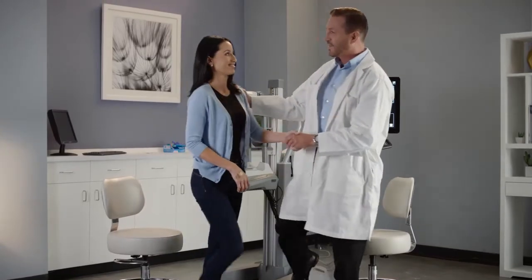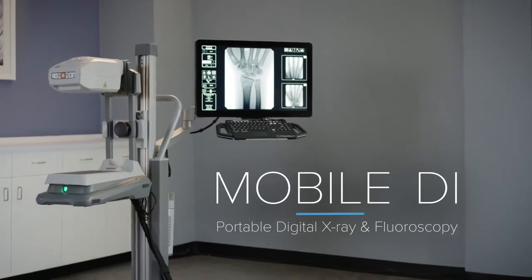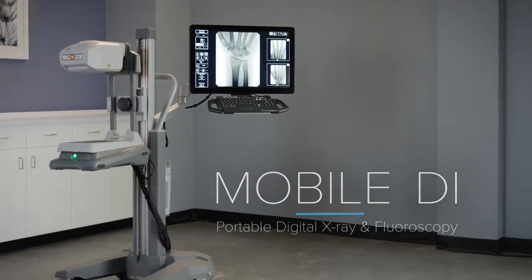OrthoScan Mobile DI. Portable digital x-ray and fluoroscopy for all of your clinical extremity imaging needs.